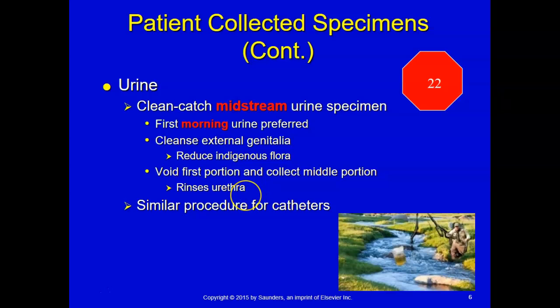So that keeps contaminants out, and if there's any bacteria that grows there, that means it should be a true pathogen. The procedure is similar for catheters, but catheters should not have any bacteria at all, whereas urine samples, we're going to get into that later, a few bacteria, especially if it's several different kinds of bacteria, are not considered significant.